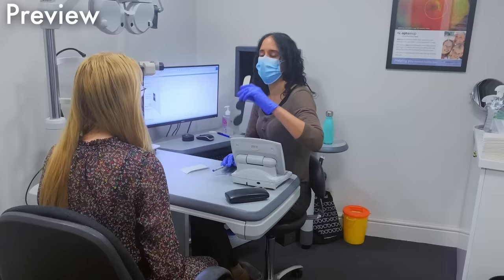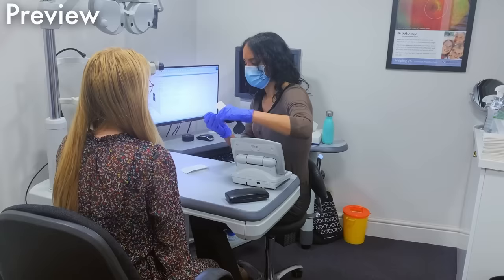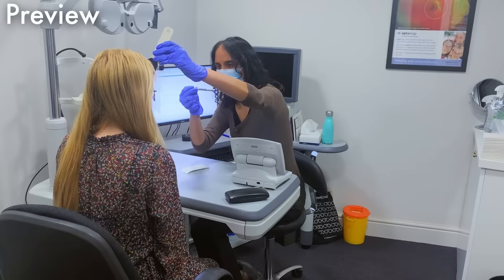So I'm just going to cover and uncover your eyes. I'll just check how well your eye muscles are working together. Okay, very good. Lovely. And then if you can look at the H for me down here next to my finger, I'm going to do the same thing again. Okay, brilliant. Thank you.